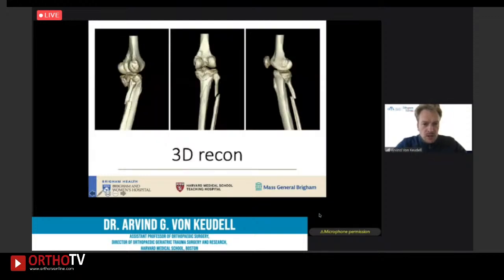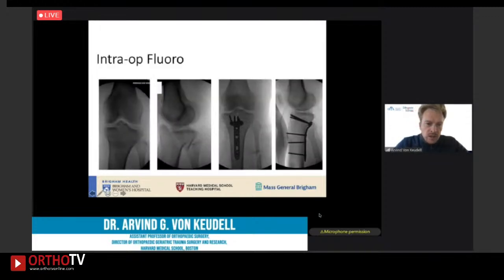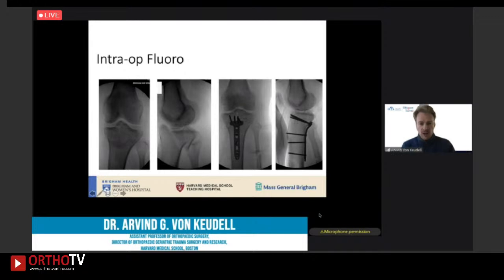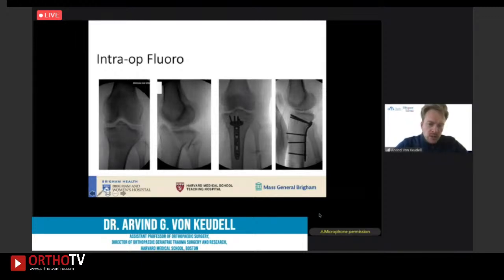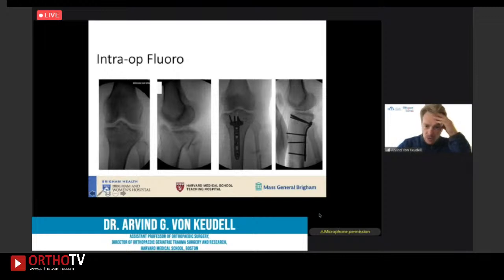3D reconstruction cuts again show the posterior lateral component of this proximal tibia fracture. Intraoperatively, before starting any posterior approaches, check your fluoroscopy — it is incredibly challenging if the contralateral leg is in the way and you cannot see your lateral view, requiring appropriate bumps in the right location. Here you can see the plate application capturing both the posterior medial and posterior lateral fragments.